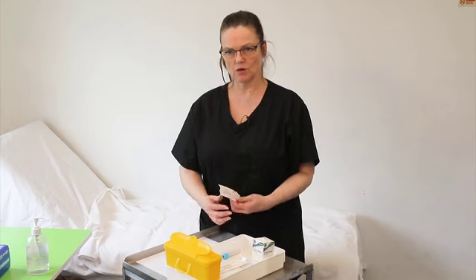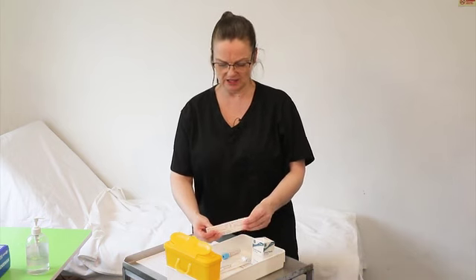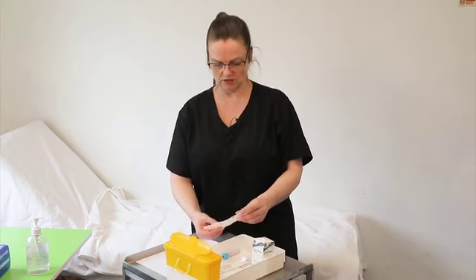And I will say that during our training sessions, I very often see nurses who, when they are preparing for adult OSCE, are drawing up the wrong amount of medication. So please do be aware that these syringes are 100 unit syringes.